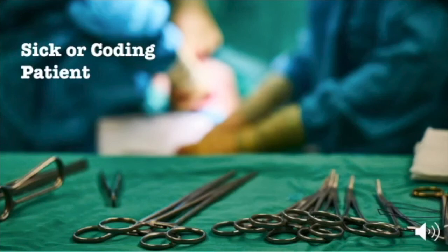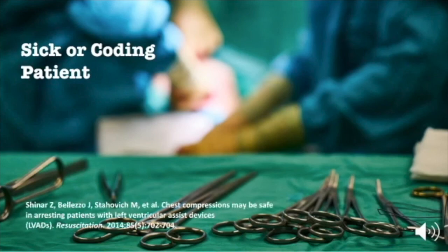A lot of clinicians disagree with this, though, and in fact, there was actually a small study done in 2014 that suggests compressions do not cause harm. I put the information for the study down below here, but basically what they did is they examined a small number of patients who received chest compressions with an LVAD. None of the patients in the study had any dislodgement of the device or any of the tubing. One patient actually received compressions in the study for 2.5 hours in the back of an ambulance prior to arrival at the hospital, and there was no dislodgement.